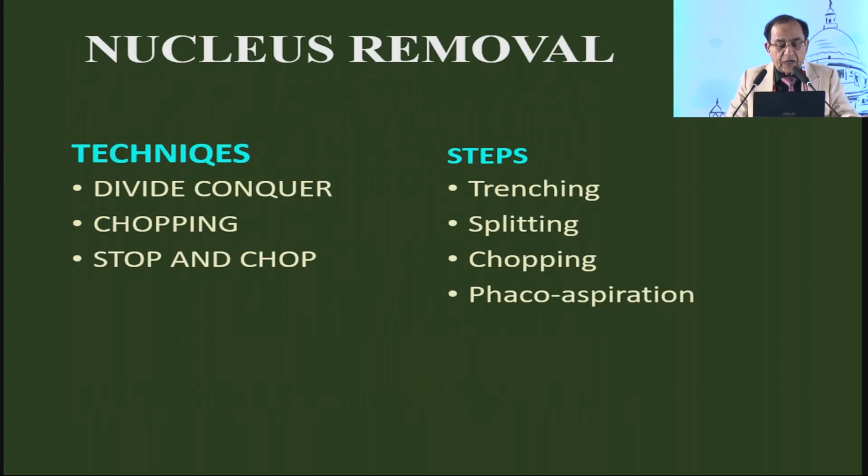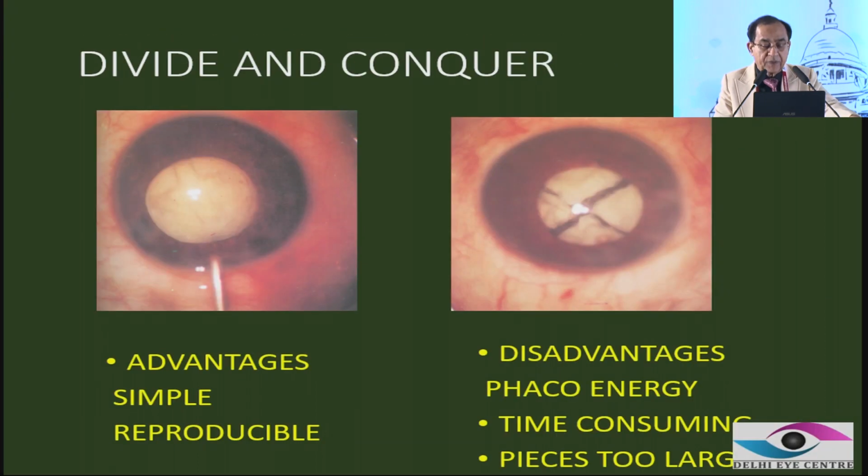The techniques are basically divide and conquer, chopping, and stop and chop. And the steps are trenching, splitting, chopping and aspiration. These are the standard steps, whatever the technique may be.